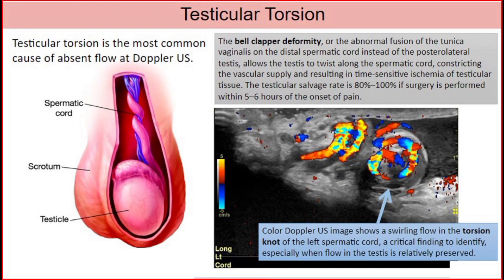Testicular torsion is the most common cause of absent flow at Doppler ultrasound. The bell-clapper deformity, or the abnormal fusion of the tunica vaginalis on the distal spermatic cord instead of the posterior lateral testis, allows the testis to twist along the spermatic cord, constricting the vascular supply and resulting in time-sensitive ischemia of testicular tissue. The testicular salvage rate is 80% to 100% if surgery is performed within 5 to 6 hours of onset of pain. This color Doppler ultrasound image shows swirling flow in the torsion knot of the left spermatic cord — a critical finding to identify, especially when flow in the testis is relatively preserved.